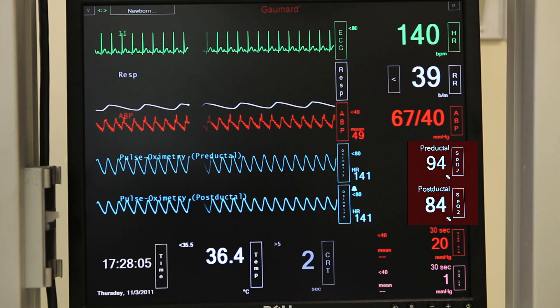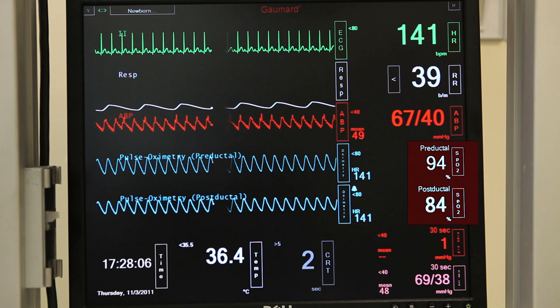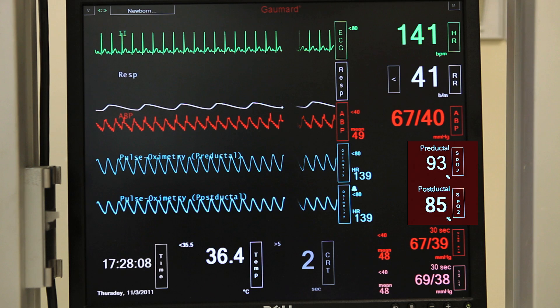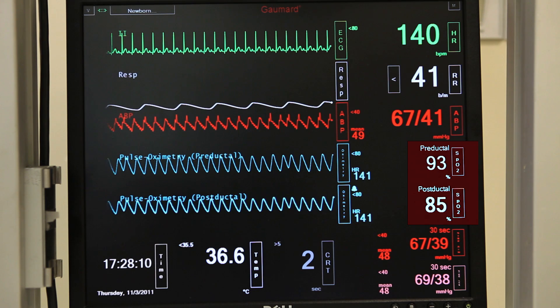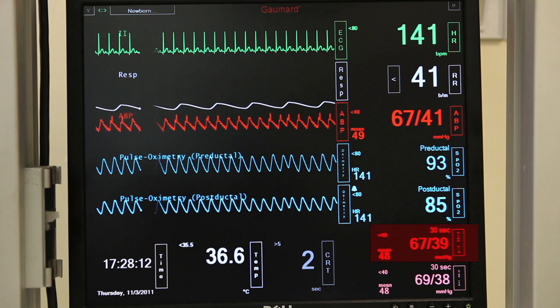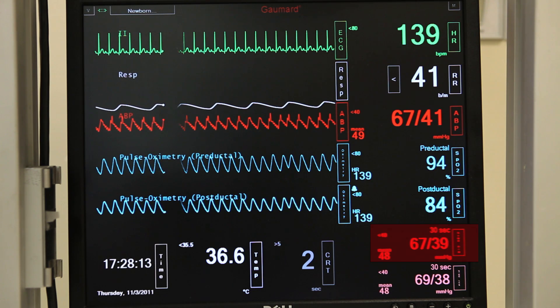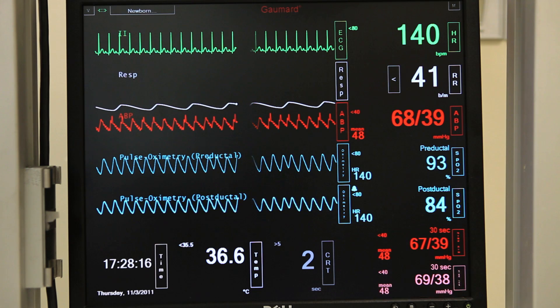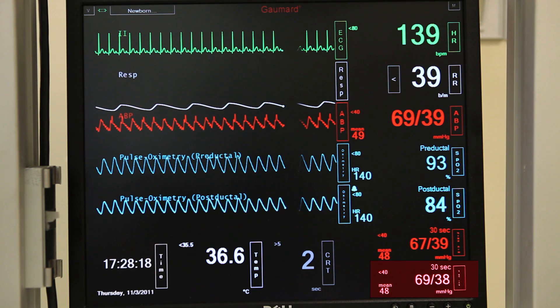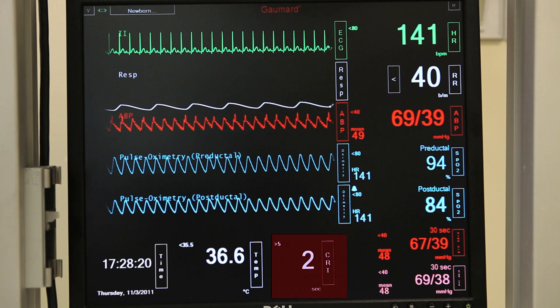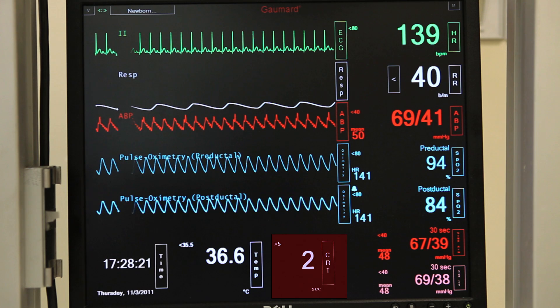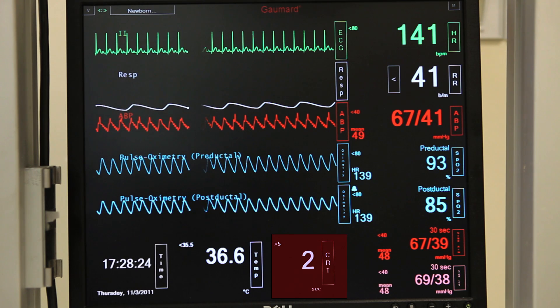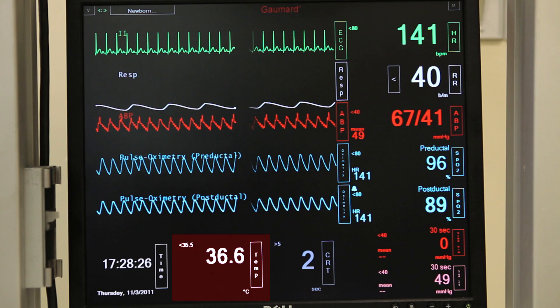We can now do pre- and post-ductal monitoring. Right now the pre-ductal is 93 and the post-ductal is 85. Below that, the top number is the blood pressure for the arm, and the blood pressure for the leg is below that. Cap refill time reads to the left of blood pressure, and to the left of that is the body temperature.